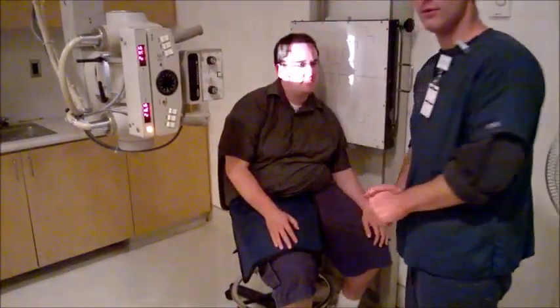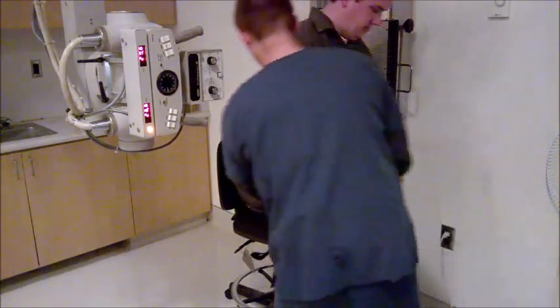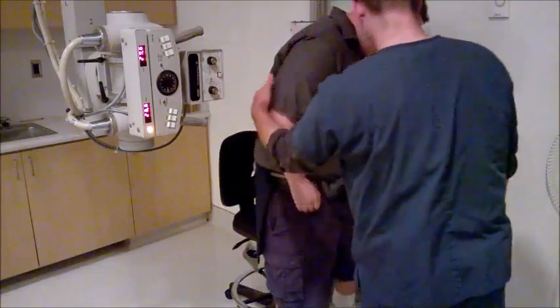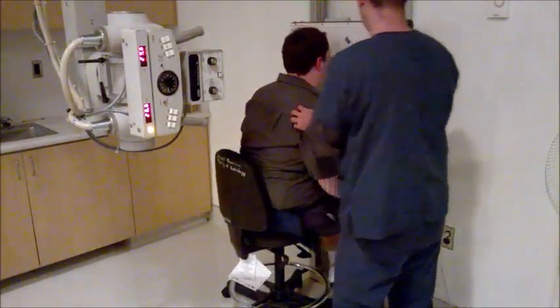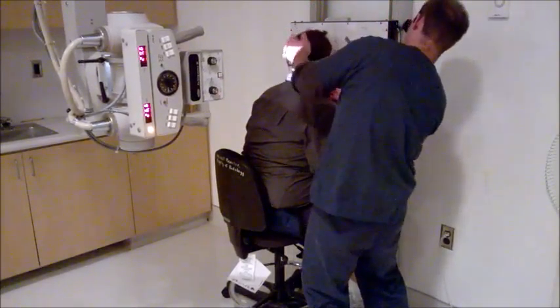Alright, now time for the Waters, the PA Waters. So I'm going to have you stand up, sir. Alright, bring it around. There you go, on your buttocks. And now have your forehead against the board right here. Yes, good. Now bring up your chin as far as you can.